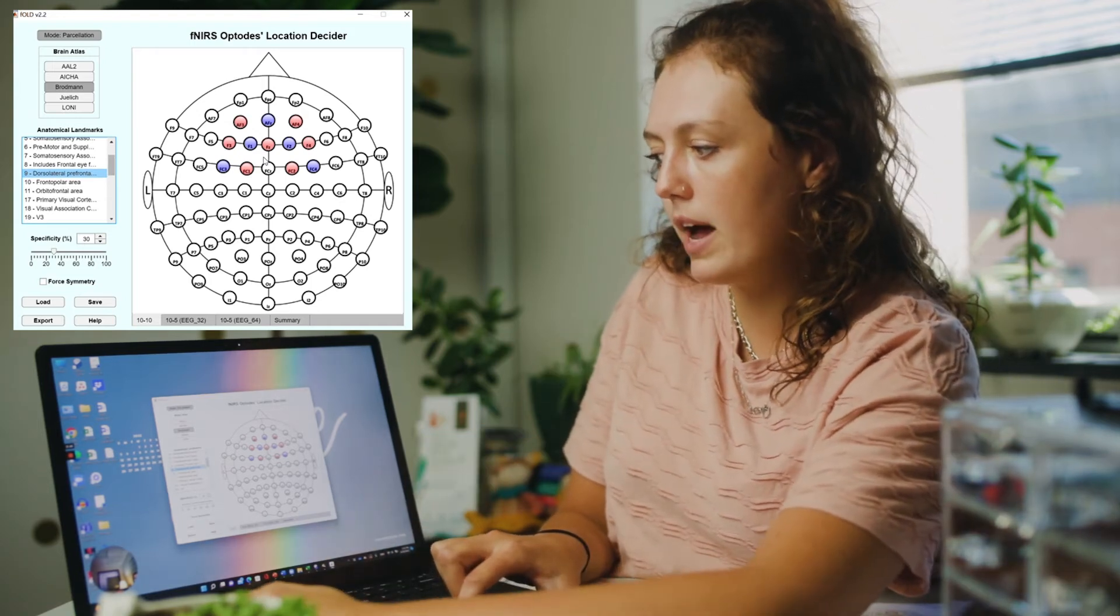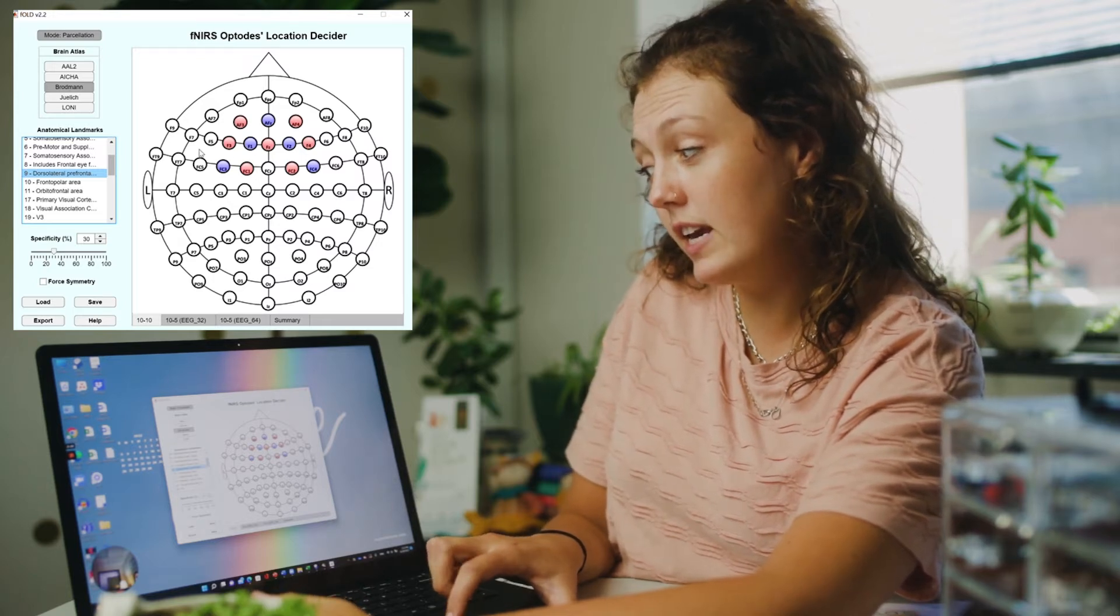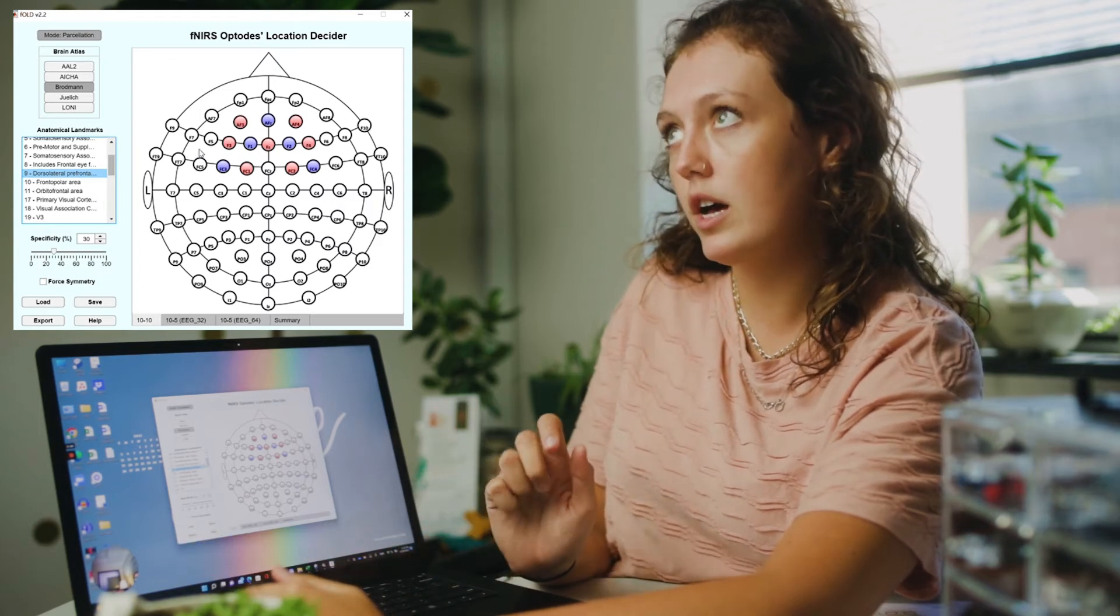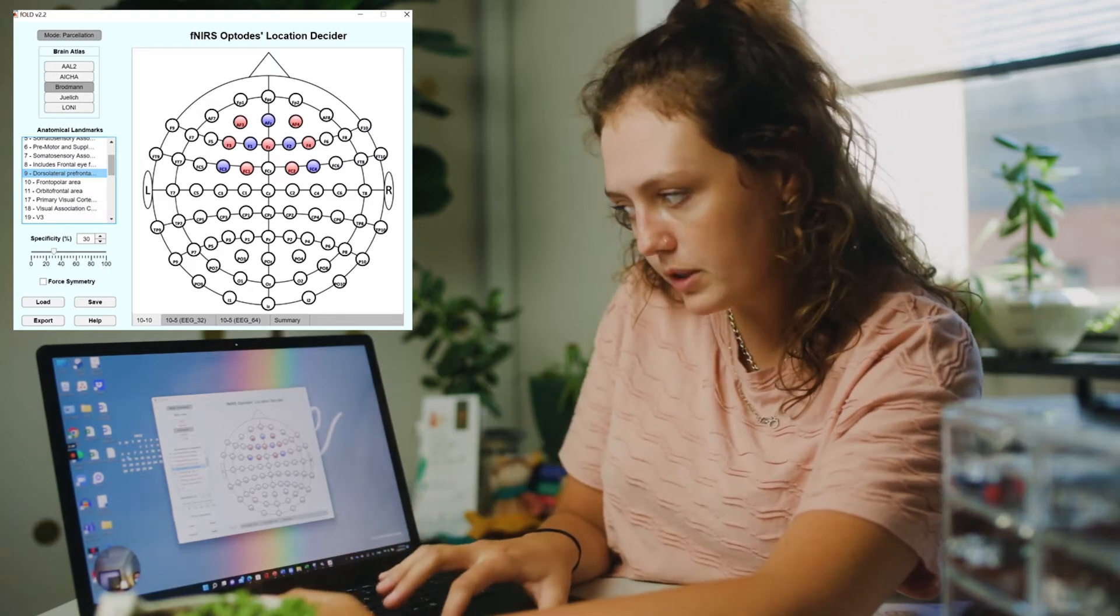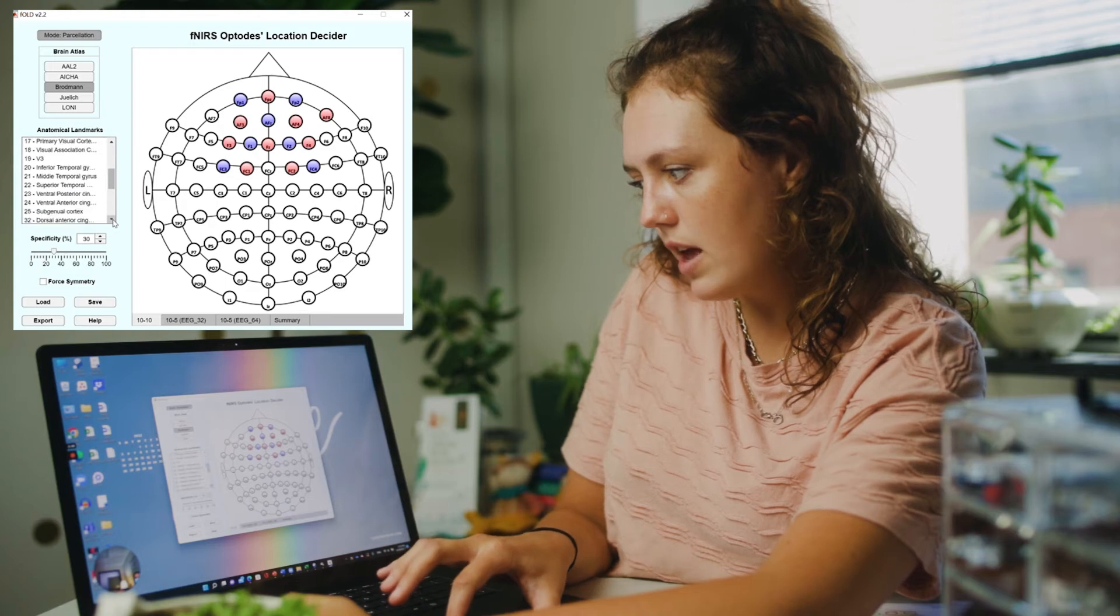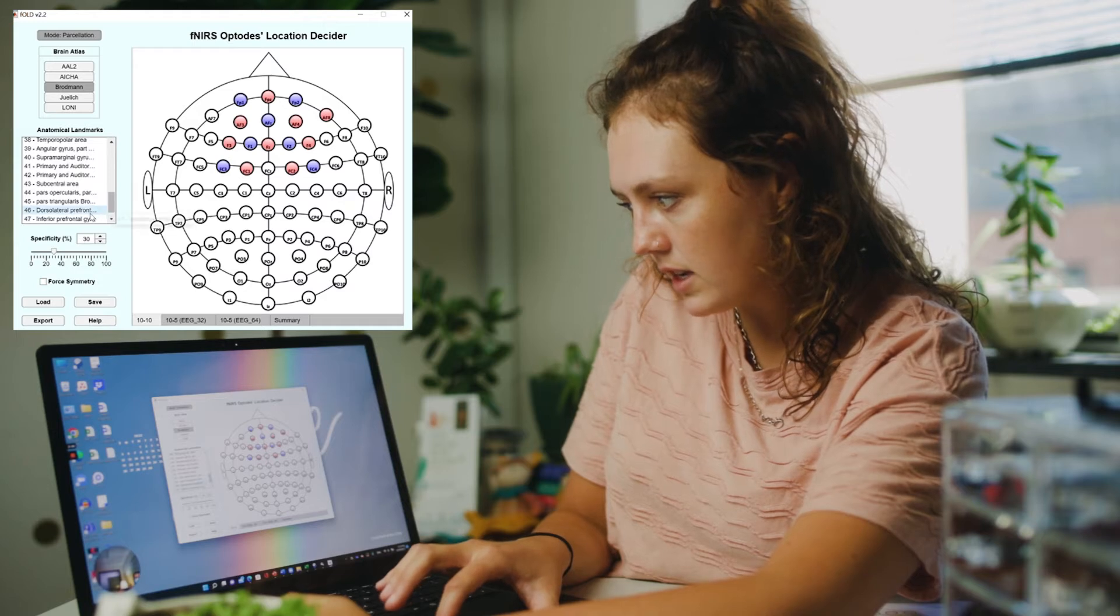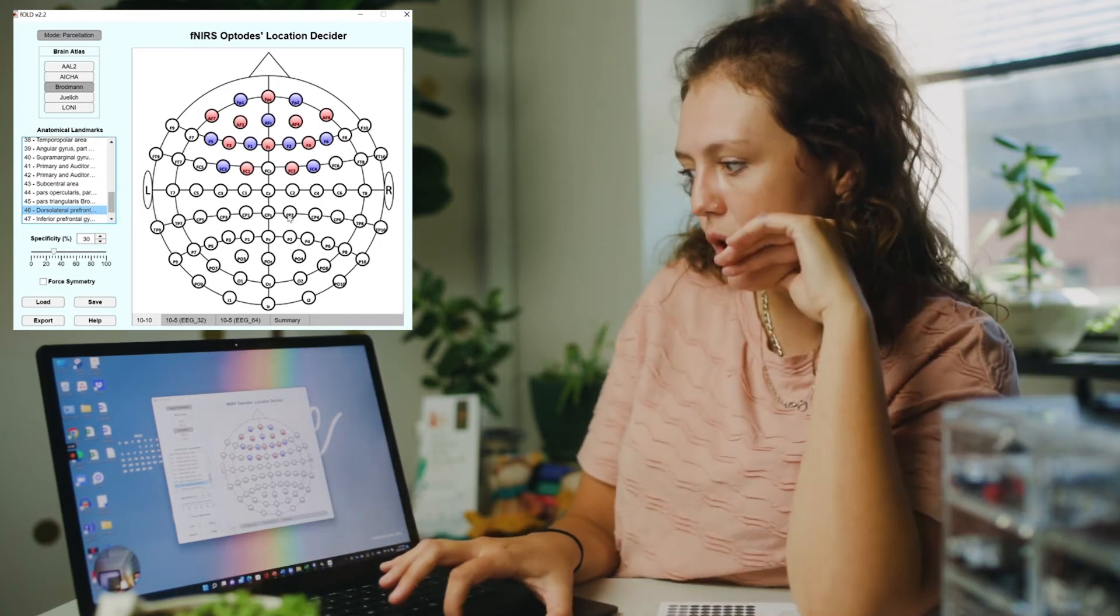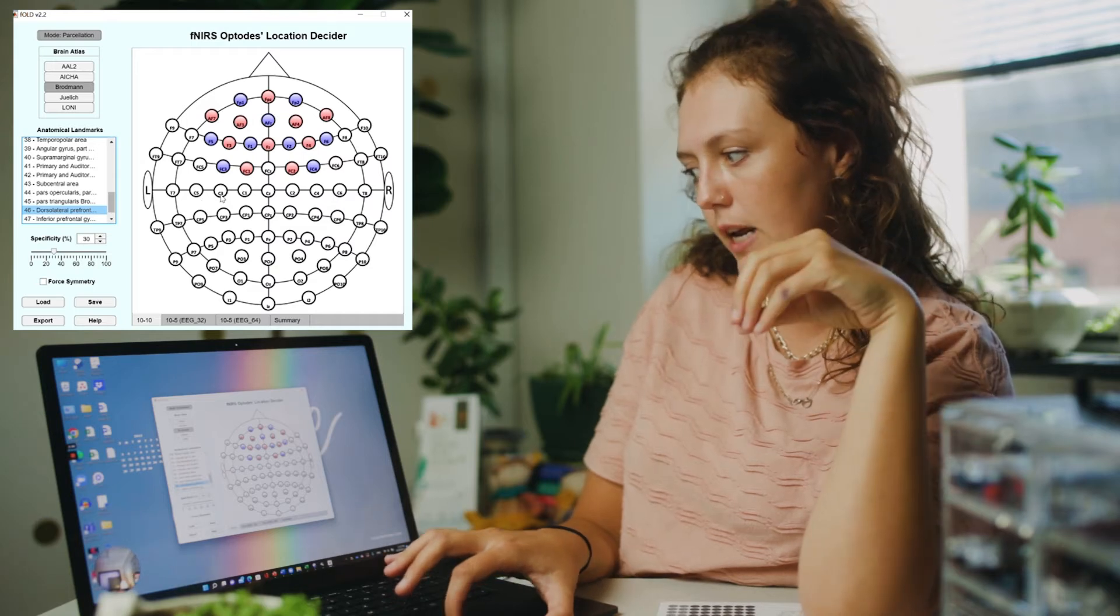I'm going to click all of my regions of interest first, and then we'll talk about the specificity and how you can change the arrangement based on the number of sources and detectors that you have on your FNIRS fibers. So I'm going to choose the frontal polar area, and then I'm going to go down to area 46 on the Brodman's area because I'm interested in this dorsolateral prefrontal cortex.